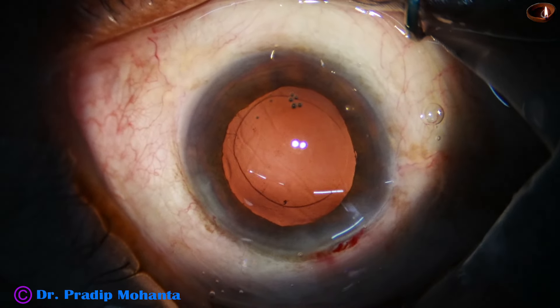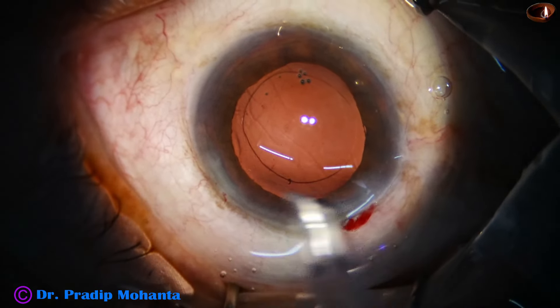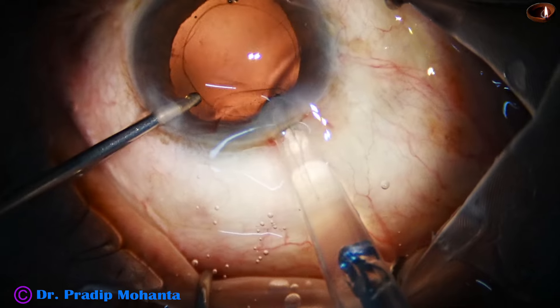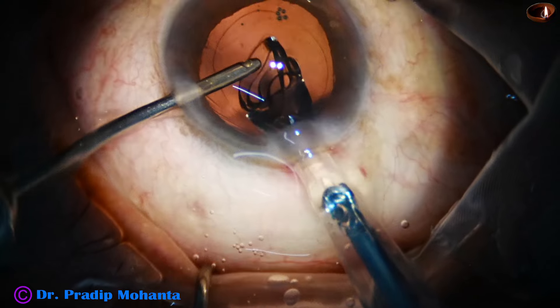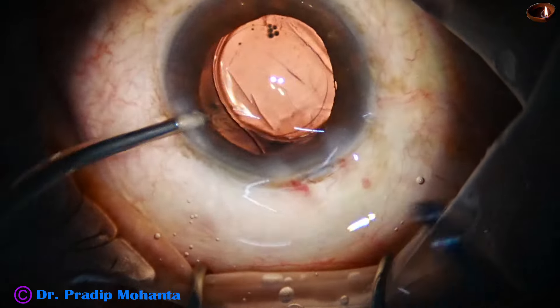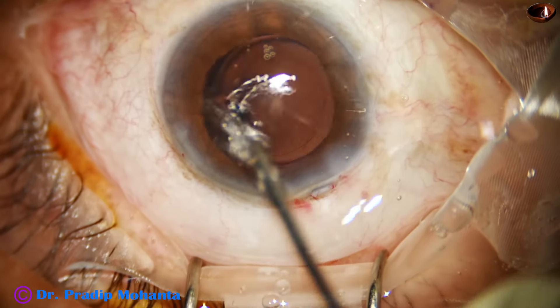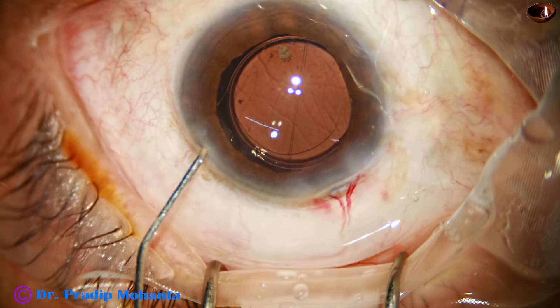Now, hydro-implantation of a single-piece monofocal hydrophilic acrylic intraocular lens. The irrigating probe is introduced and keeps the chamber formed while the lens is injected. The irrigating cannula supports the anterior surface of the lens as it comes out of the cartridge. The left-hand instrument is then used to place the trailing haptic in the bag. The irrigating cannula itself is used to dial the lens, and the lens is now nicely placed.